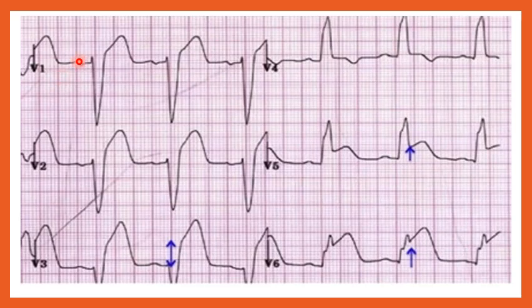Over on the right, we look at V1. Over on the left, we look at V6, which again doesn't really have this wonderful shape to it. We can look at its next door neighbor, which is V5, and we see an M type of appearance. Over here we see right ventricular activation and a huge, wide S wave in V1.